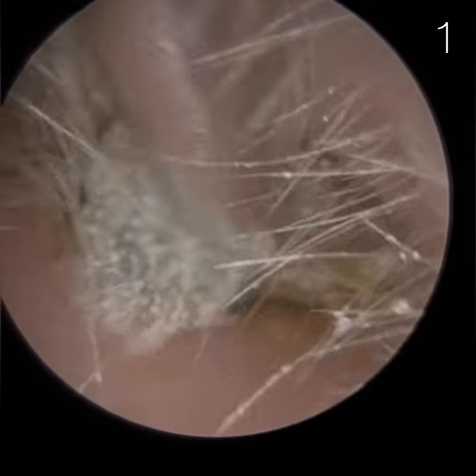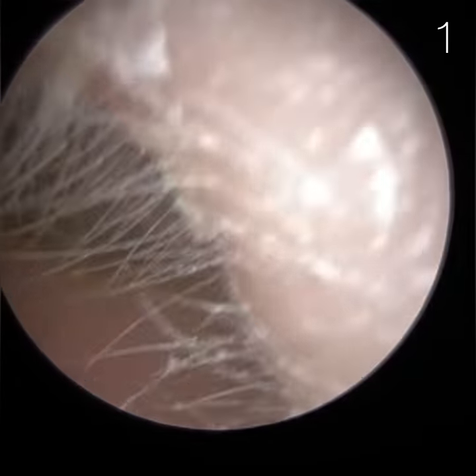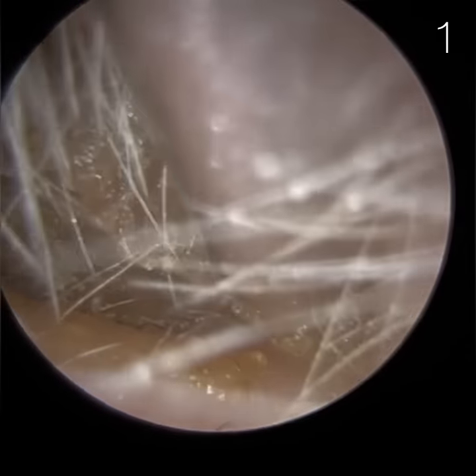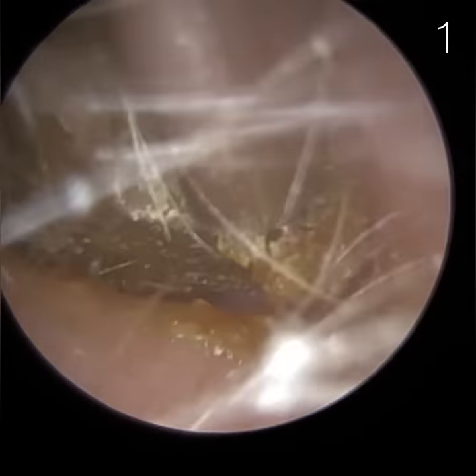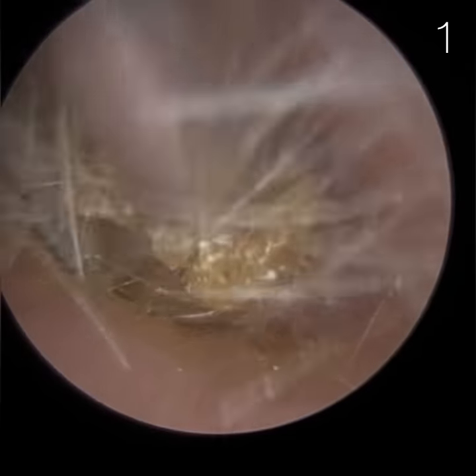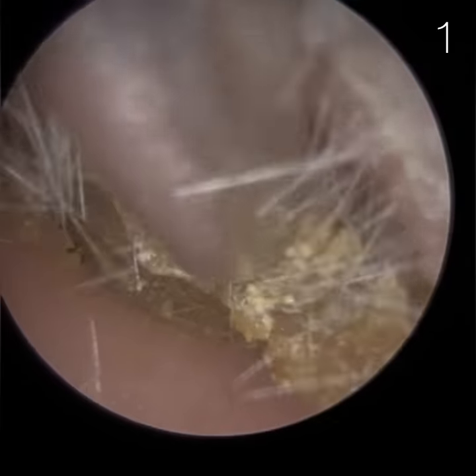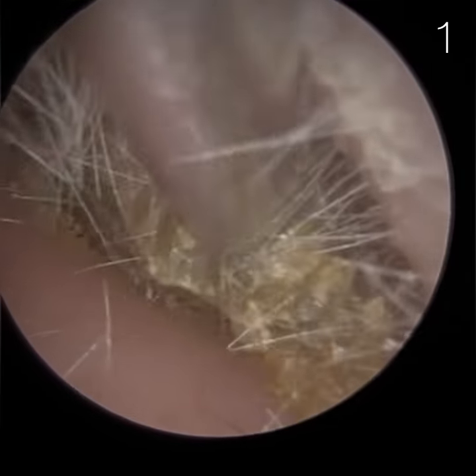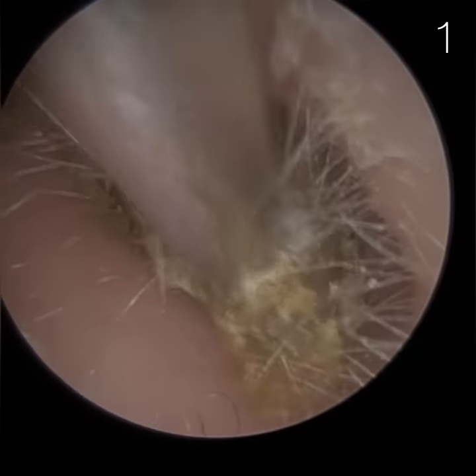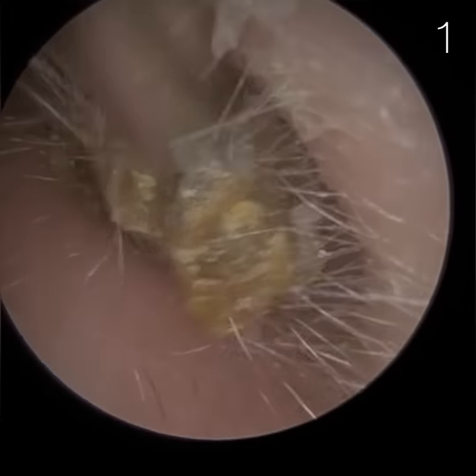This patient attended with a blocked left ear, and it's a combination of earwax and dry skin. This plug is extending from the entrance where we are now, and we know we're at the entrance because of all of these hairs. The hairs in the ears should only be located on the outer third, the cartilaginous portion. That's where the hair follicles are found. In the inner two-thirds of the ear canal, the bony section, there shouldn't be any hair follicles and therefore no protruding hairs extending from the ear canal surface. You may get some loose or matted hairs, but there shouldn't be any active hairs growing.